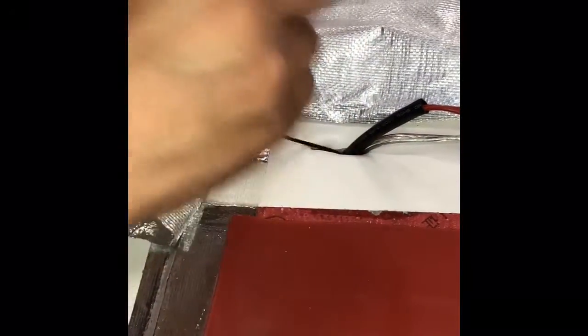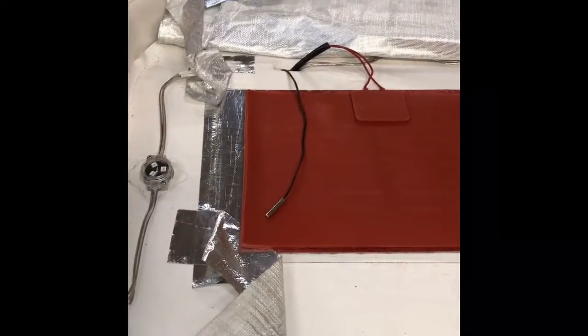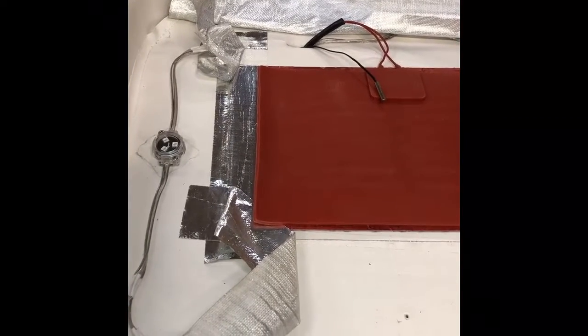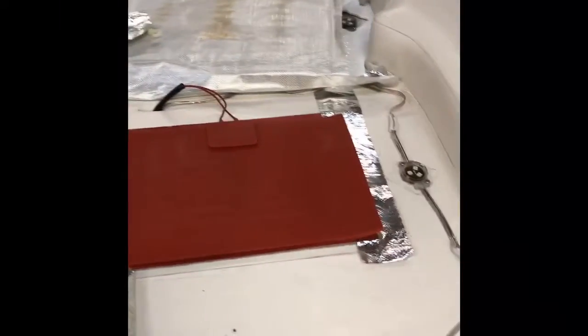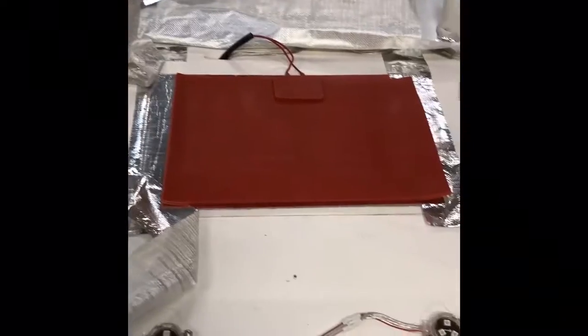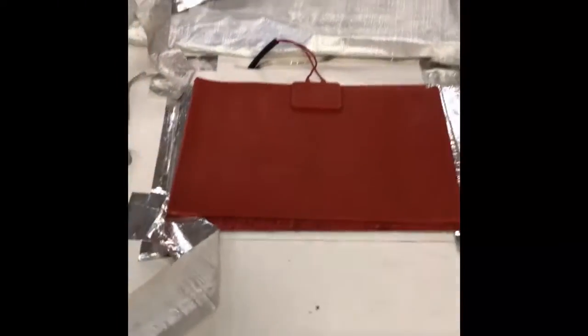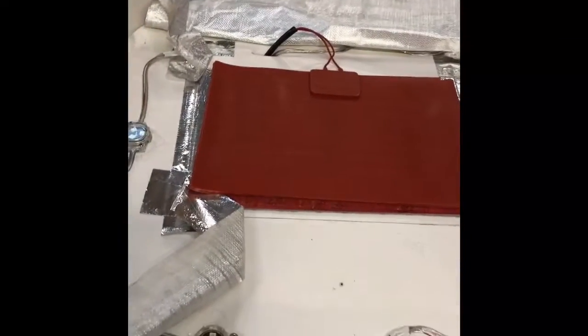Or you could actually do it from the top. It will be much easier than the bottom. It's gonna save you time. So this is pretty much the sensor. There could be three things basically wrong with it if the foot part is not heating up. First, it was the fuse, which we went over. The second is going to be the heating pad, which is this right over here. And the third is going to be the thermal fuse.